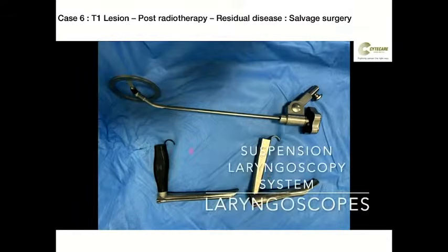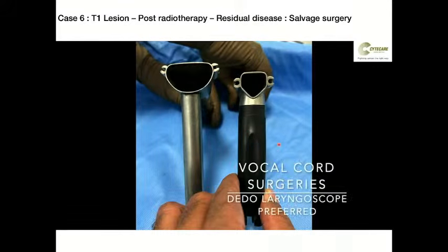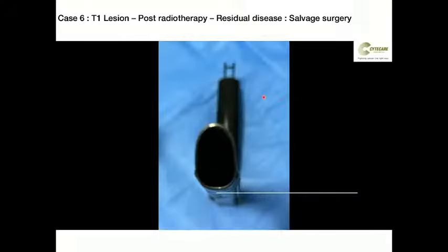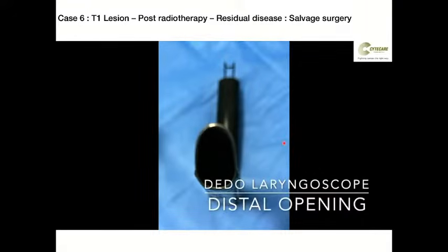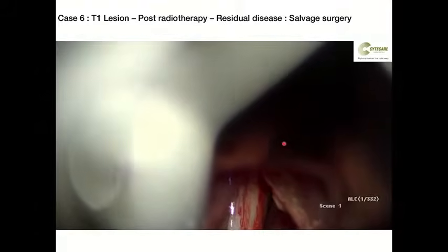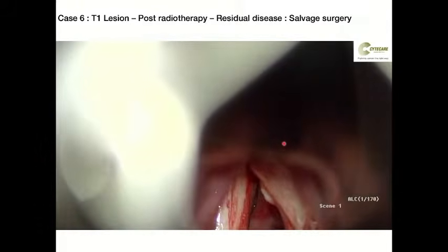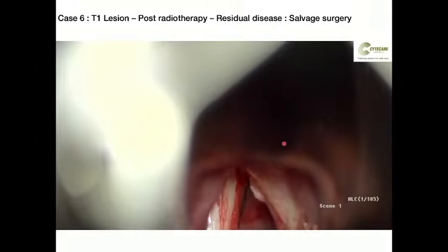Okay, salvage surgery. This was a case of T1 vocal cord cancer treated with radiotherapy and had a residual or a recurrence at about 2 years' time. So this was one referred from Ahmedabad. One of my head and neck friends had referred this case. You can see this is the examination under anesthesia. Lesion in the anterior third vocal cord.